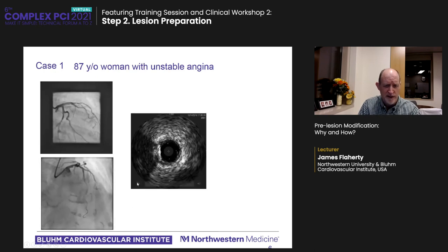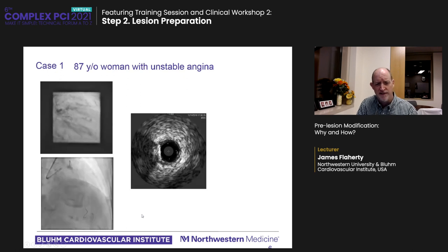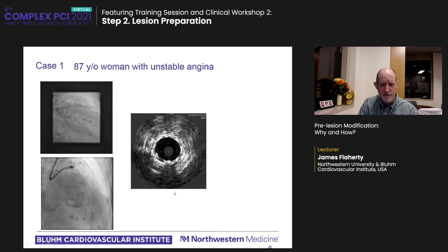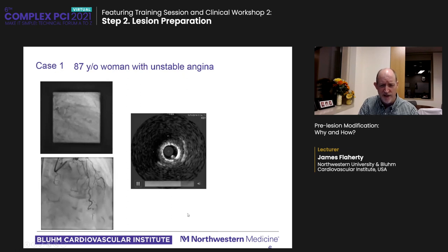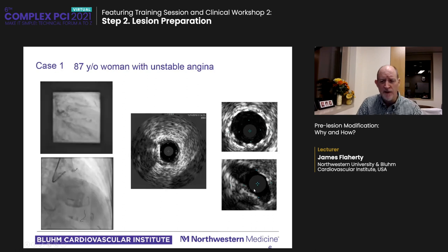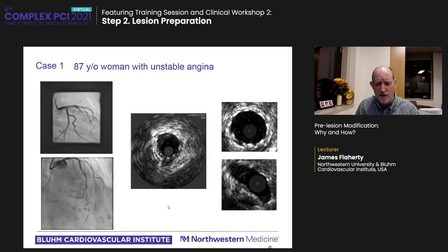Well, you really need to do intravascular imaging to understand how good a result is, because angiography can be misleading. And you see there, if it whizzed past it, he had a very eccentric, underexpanded stent in that one focal area.